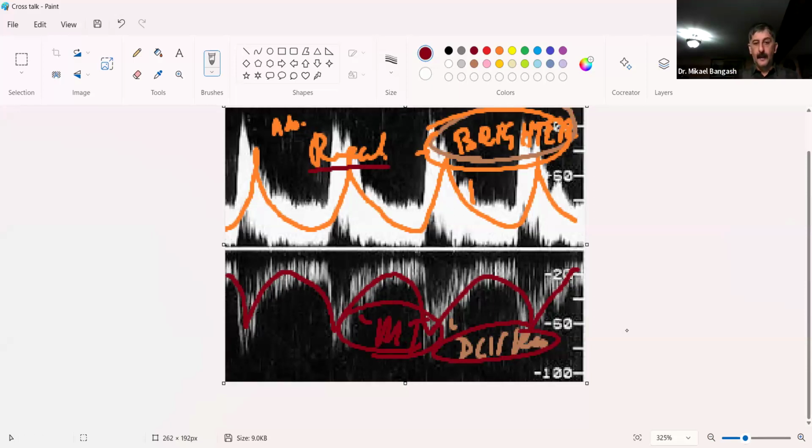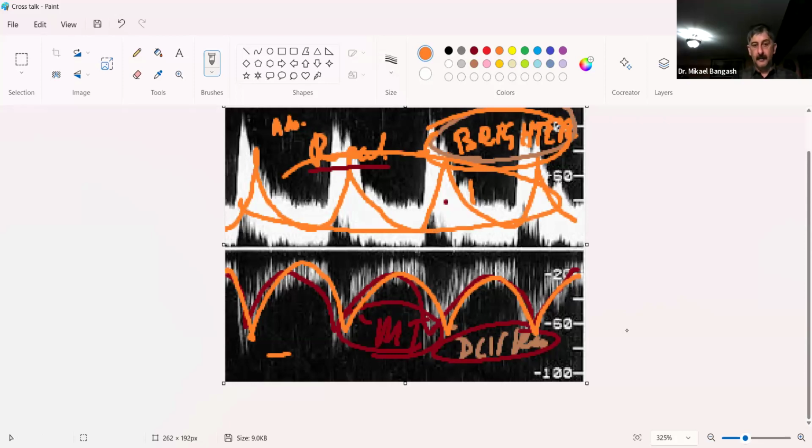Had this reflection been seen down here, the brighter one being down here and the darker one being up here, then we would have had a negative Doppler shift, with this one looking like this being the artifact. Did you guys get that?